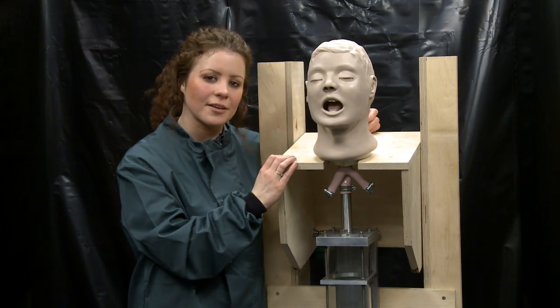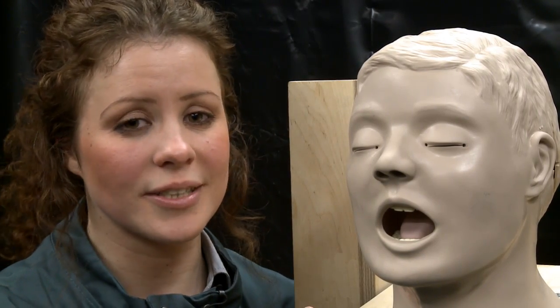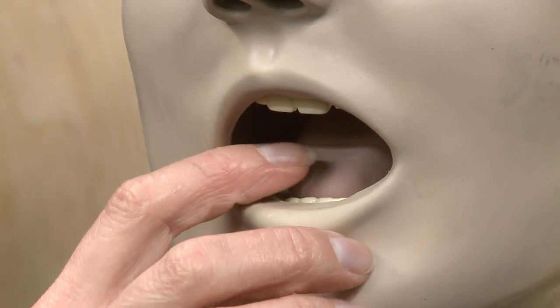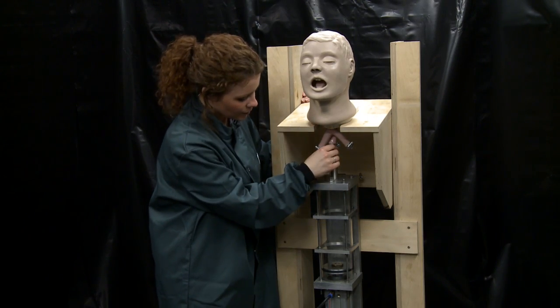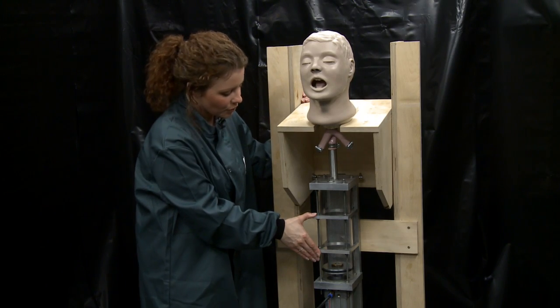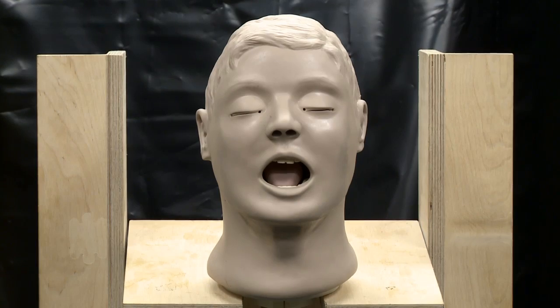We're in one of HSL's controlled air chambers, and this is where Vomiting Larry lives. He's comprised of a mannequin head known as Airway Larry, and is what medical students use to practice procedures such as laryngoscopies. He has a tongue and teeth so that fluid is projected in a realistic way. The esophagus is connected to a chamber representing Larry's stomach, to which we add fluid. A pneumatic ram then forces the fluid up and out of his mouth.